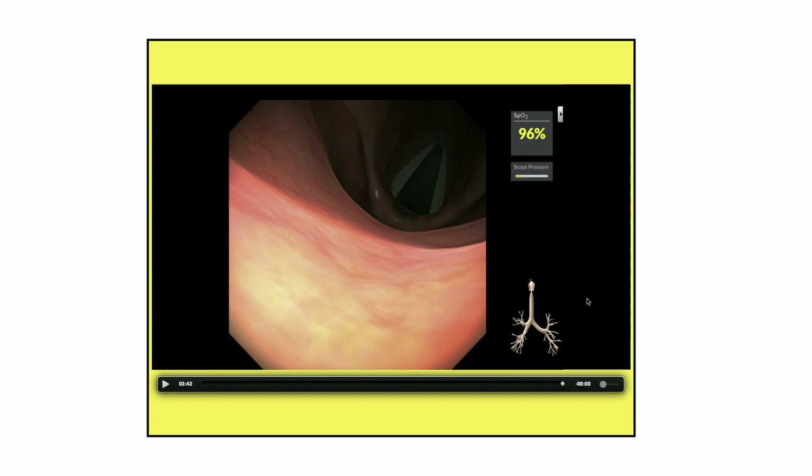So this is the normal anatomy that we will encounter during the flexible bronchoscopy. In our coming workshop, you can play with different scenarios to go through some difficult airway anatomy and have hands-on practice on the flexible bronchoscope.